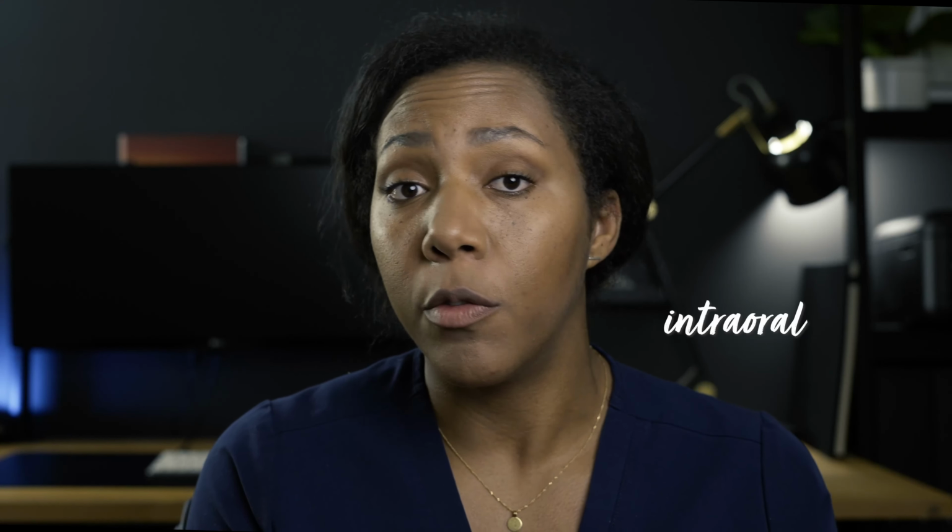Boy. In this video, I will stick to the types of shots that I take for a new patient exam, which is helpful in the treatment planning process. I will have a video coming up on the different types of gear, which is helpful, and also techniques. So let's start with the intraoral photos.